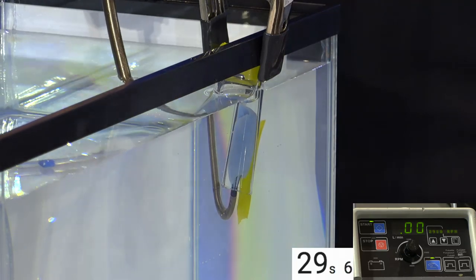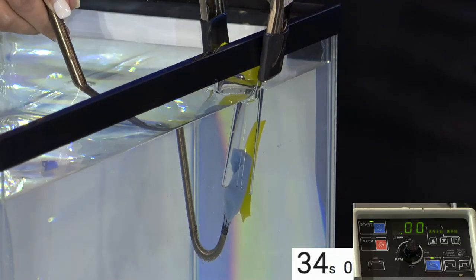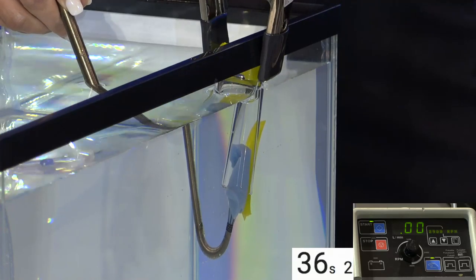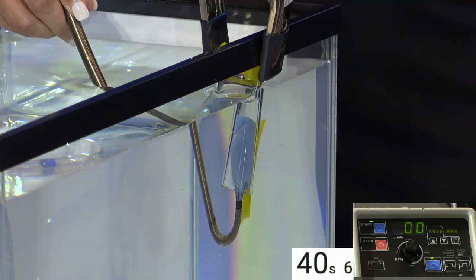Yeah, do it. So this is an important point. Getting to zero flow, one of the things that people often want to do is take the cannula, take the pump and turn it off because they're at zero flow. Bad idea. It's the opposite of what we want to do.